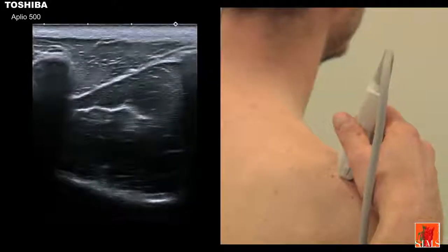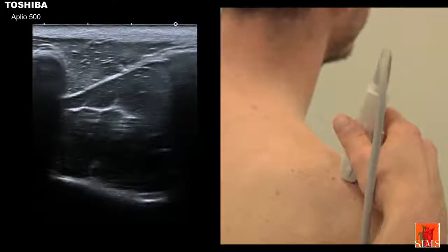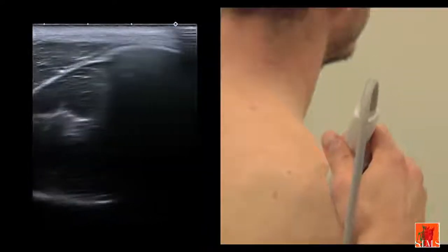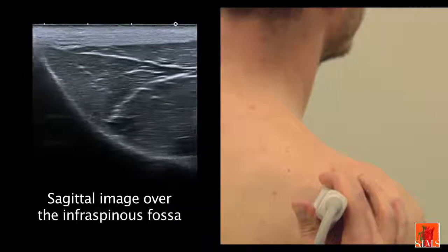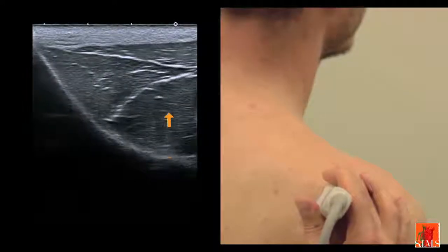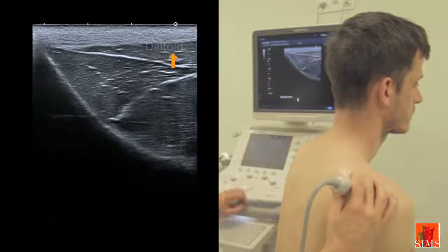In order to obtain a fine sagittal view of the infraspinatus fossa, let's start from the sagittal view of the supraspinous fossa that we looked at a minute ago. We move backwards over the spine of the scapula and follow this beautiful bony slope seen deep to the image, which corresponds to the floor of the infraspinatus fossa. Superficially, we can observe the curve of the infraspinatus muscle located deep to the posterior bundle of the deltoid muscle.